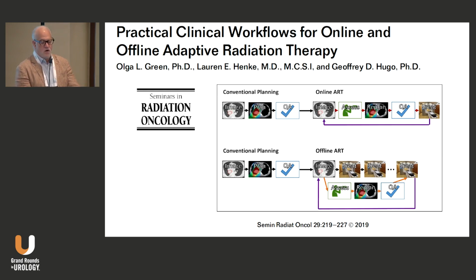For offline RT, again, you have that information going on, and then if you look at the graph, you're treating the patient, and then at certain points you're capturing some of these CT scans and either averaging, summarizing them using AI. You're making something of it to basically look at what you're capturing. Are the organs in the same place? Is the tumor in the same place? Has it moved? What's going on? And then you make changes that way.